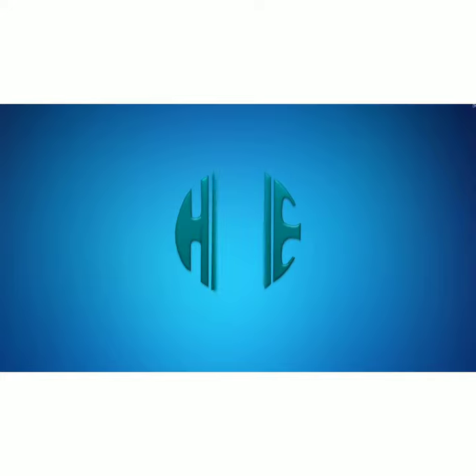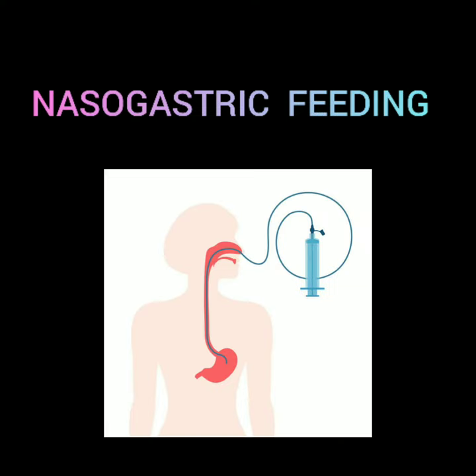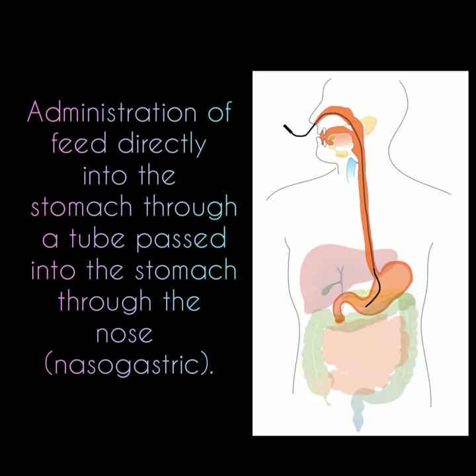Hello everyone. Today, the clinical instructor along with the students of Holy Family Institute of Nursing Education will be demonstrating a procedure on nasogastric feeding. Definition: Administration of feed directly into the stomach through a tube passed into the stomach through the nose.